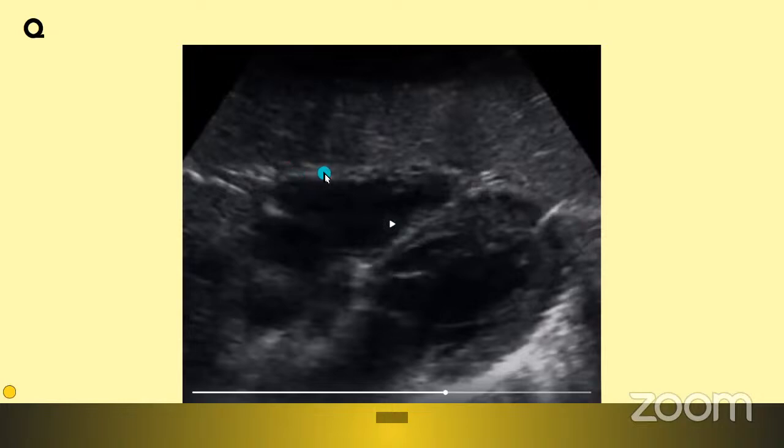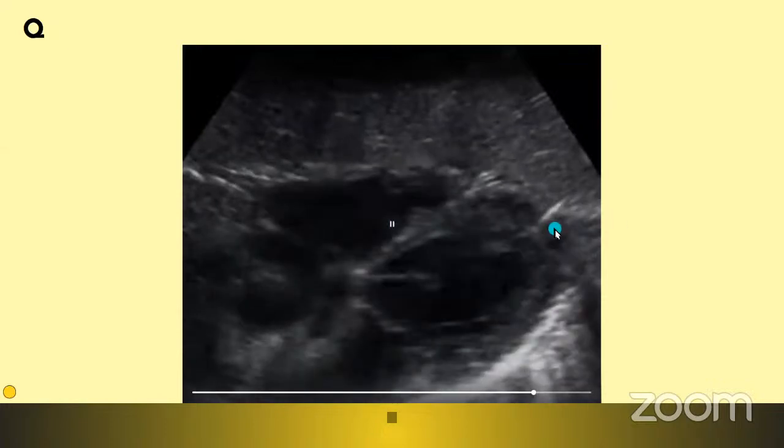This is the potential pericardial space, right? You can see a dark line. Let me annotate it. So this is the dark line. I marked it with yellow. So this is the pericardial space. Pericardial space has minimal amount. It's not like completely 0 ml. It has minimal amount of fluid. And hence you can appreciate the two layers of the pericardium. Fine.